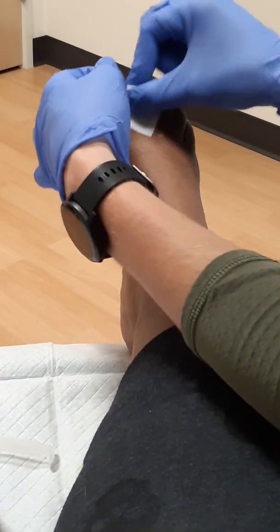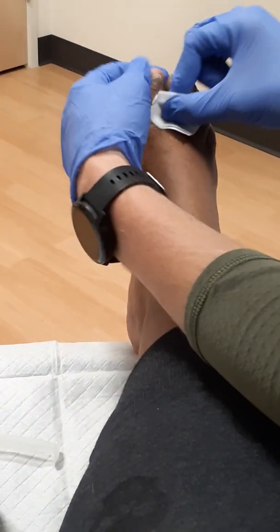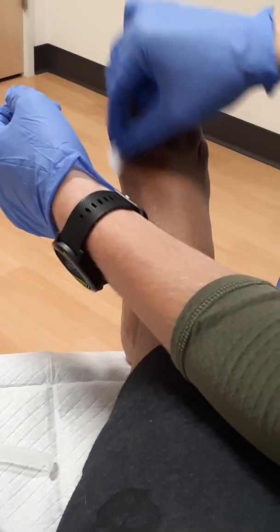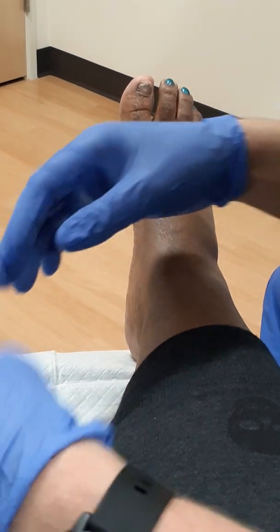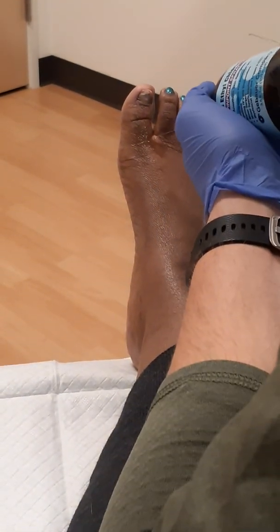This is a cold spray that helps numb the skin so you have less pain when I'm giving you the shot. Okay? Like I said, this is the worst part. Like I said, you're okay. You're welcome to record if you want, but this is probably the one step you may not like to see if you don't like needles. Okay? All right. Do this as quick as we can, get you done, okay?